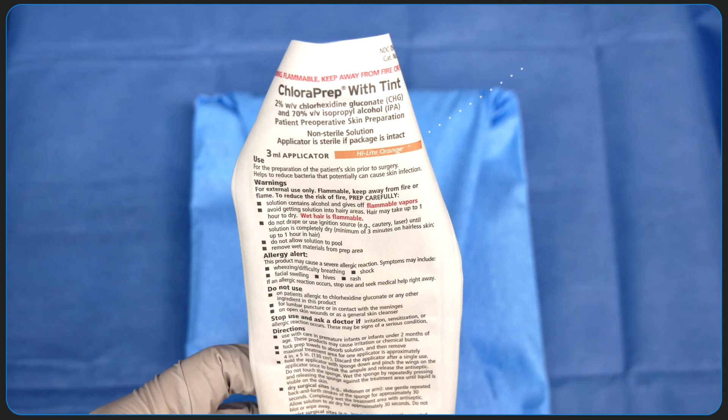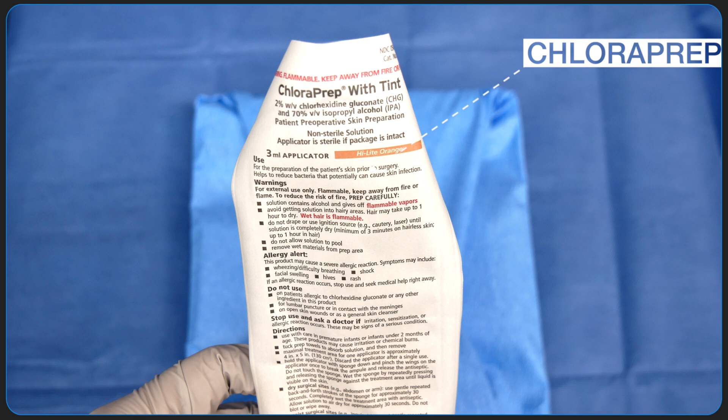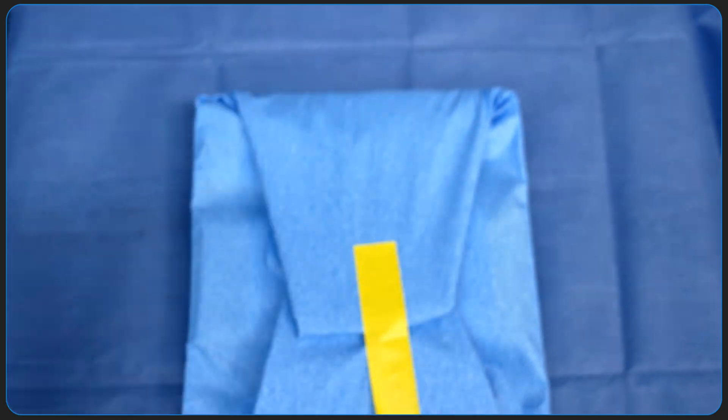First things first, this is a chloroprep applicator that we use to routinely clean the patient's skin prior to performing the procedure. It contains 2% chlorhexidine gluconate and 70% isopropyl alcohol.